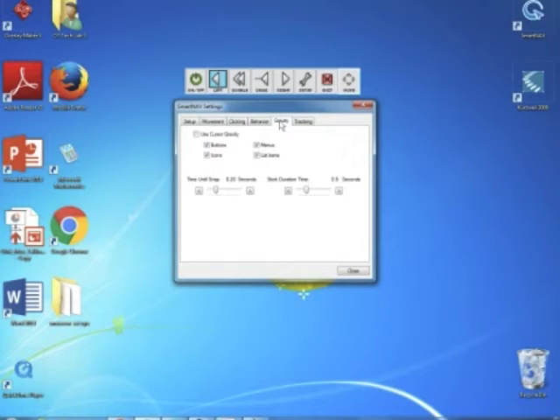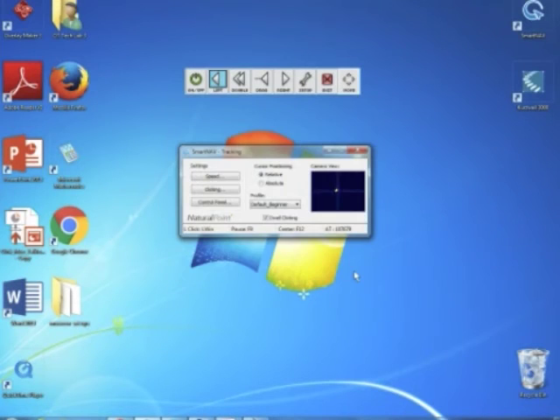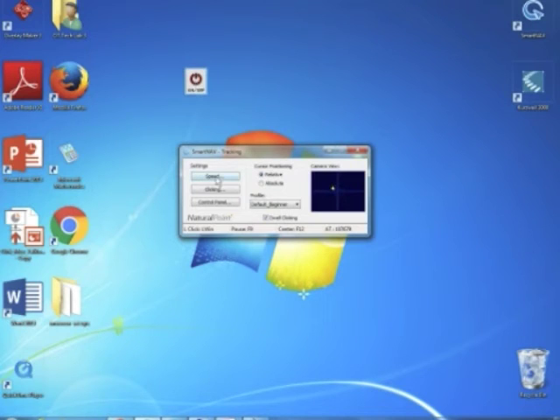You can also turn on the gravity control, which automatically pulls your cursor to the closest icon or button. This feature allows you to more easily access your intended target. Finally, to avoid unintentional clicks, you can pause dwell clicking when it's not needed, using the on-off tab on the toolbar.